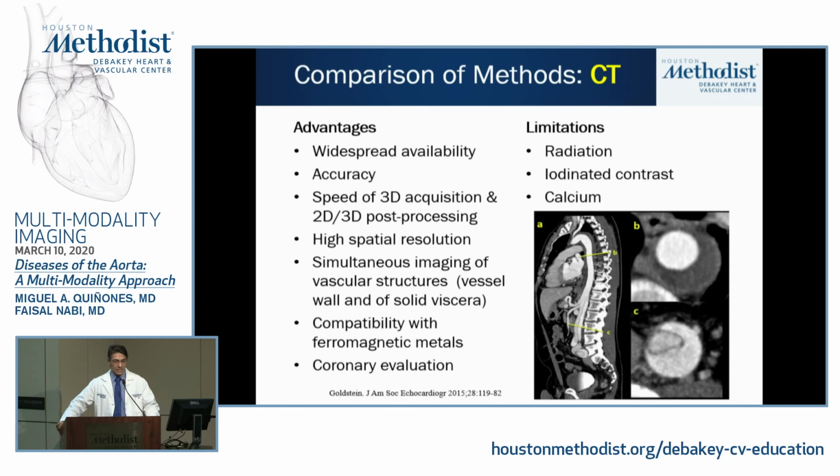What are the limitations? Of course, you are delivering radiation to your patients. We've made a lot of effort to decrease radiation doses, and that's for another talk, but we have a lot of protocols in place to help limit radiation dose to our patients. You are receiving iodinated contrast. Some patients can be allergic to it. There is some concern of contrast-induced nephropathy in a certain patient population. And of course, a lot of that you try your best to preempt.